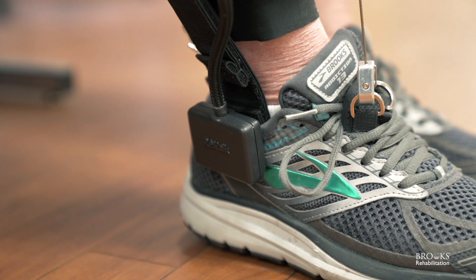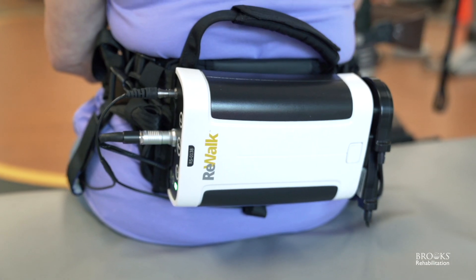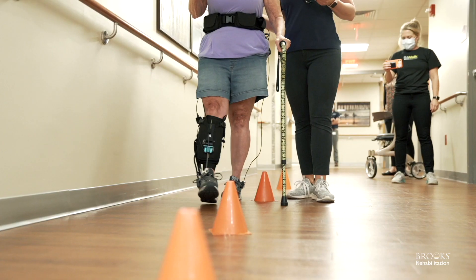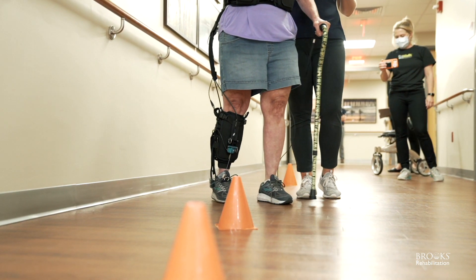I thought it would be uncomfortable, but it's not. The training process was, at the beginning, very user-friendly — getting to know the equipment. It's different than any other piece of equipment we have because now we have the plantarflexion option, compared to a traditional AFO where we only have a dorsiflexion assist. So I think this is going to be super beneficial where we can get the dorsiflexion and plantarflexion at the same time.